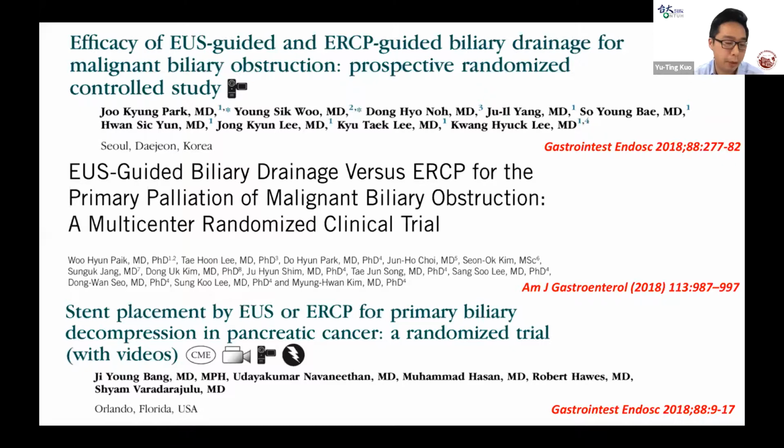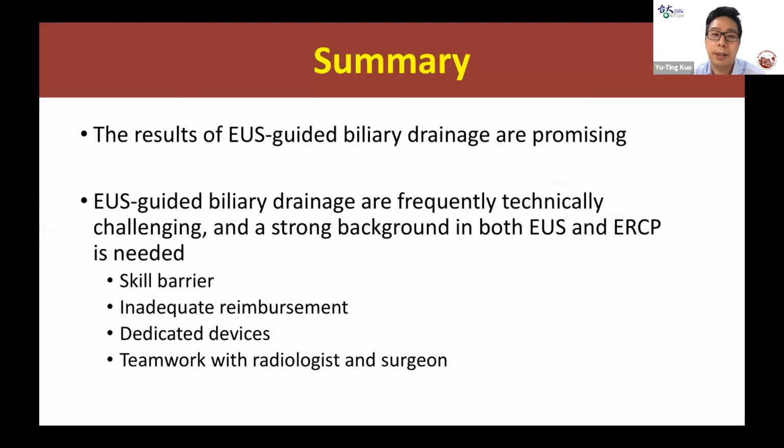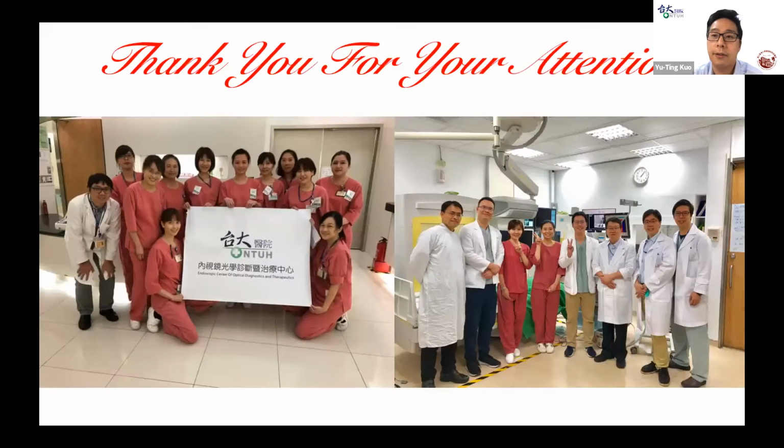Because time is limited, I will skip the final slides. So I want to summarize. EUS-guided biliary drainage is very promising, but this kind of biliary drainage is sometimes still a technical challenge, especially EUS HGS. So you need to have very good assistance to help you, and you need to teamwork with radiologists and surgeons to back you up. And the most important, you need to have dedicated devices and stents. Okay, thank you for your attention. Thank you.